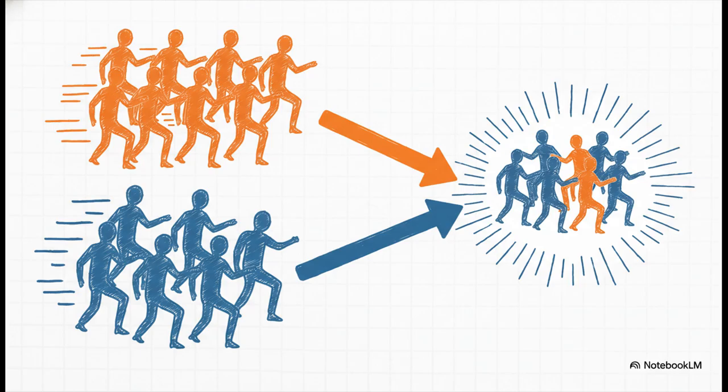Think about it. When everyone turns around, those super fast, over-enthusiastic dancers who were way out in front, they're now at the very back. And the slowpokes who were lagging behind, they're suddenly in the lead. So what happens? They're all essentially racing back towards the starting line. And for one perfect, beautiful moment, they all cross that line at the exact same time, totally in sync again.